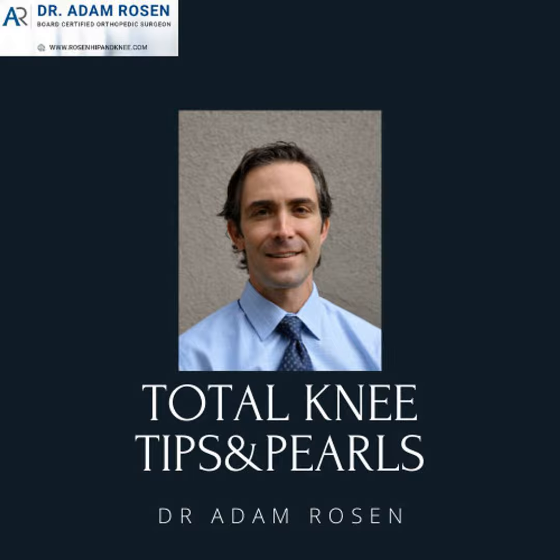Next, I'll remove the retractors medially and move everything over laterally. Again, using that mobile window philosophy, because typically these are tight to begin with. And at this point now you have retractors laterally. You may need to flex or extend the knee to get exposure at the different aspects of the femur.